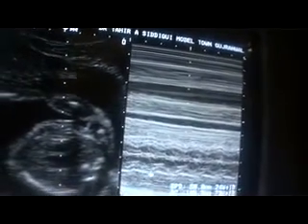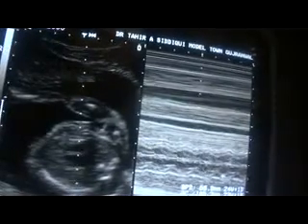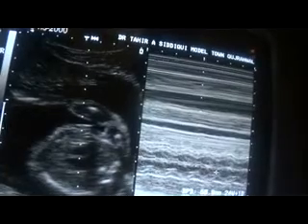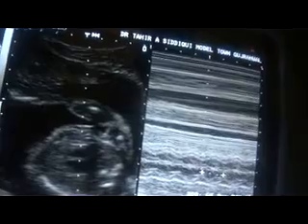Let me slow down. This is the waveform and we are getting the cardiac activity of 144 beats per minute and the waveform is regular.